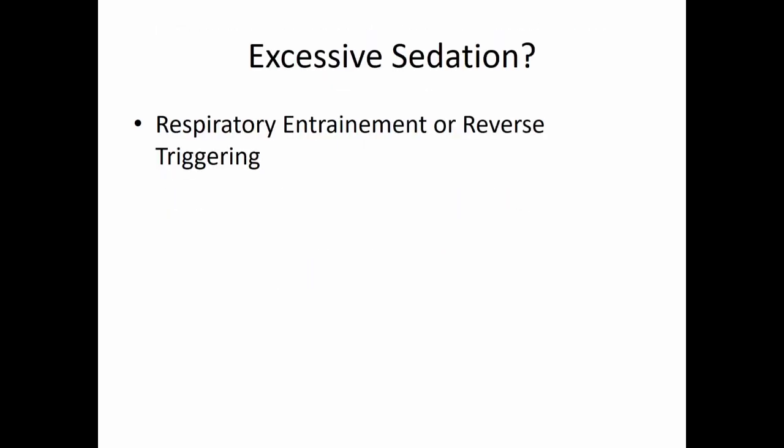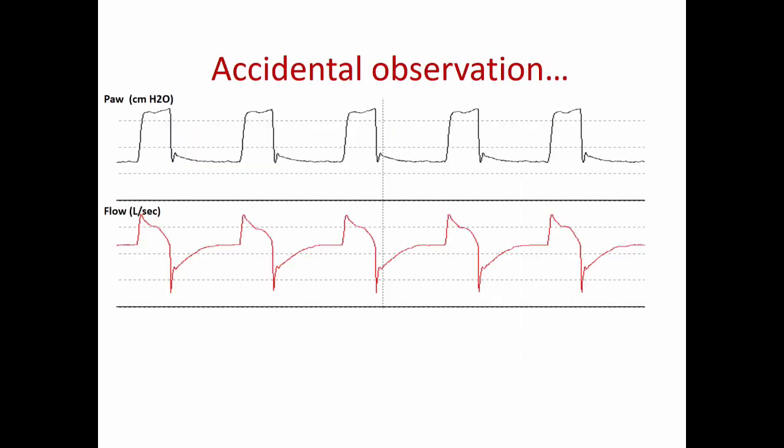Next slide, I'm going to finish with the last desynchrony, which is very frequent and which we call reverse triggering or respiratory entrainment.